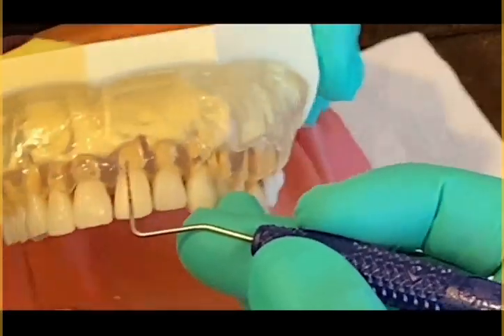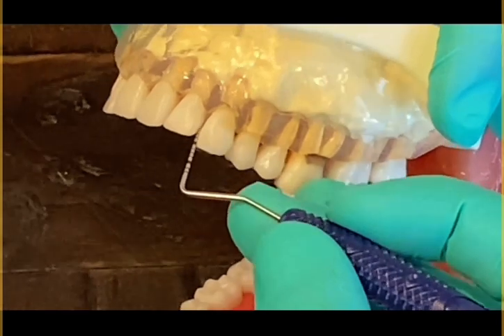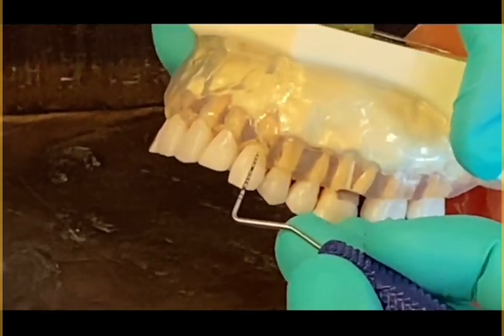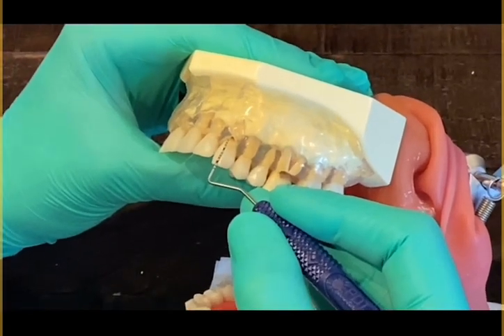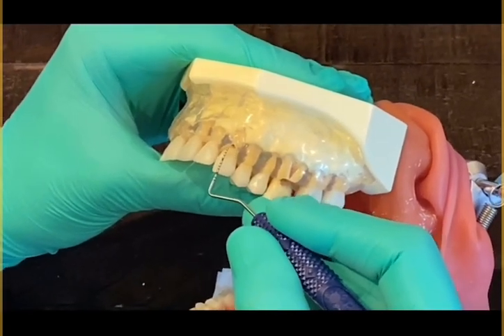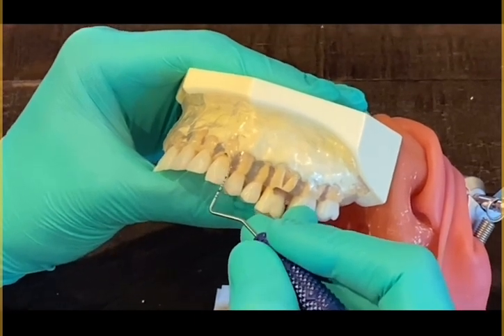Now I'm going to teeth 11 and 12. When you cross the midline, the order changes. Instead of going distal line angle first, you start at the mesial line angle to interproximal, mesial line angle to distal line angle, and distal line angle interproximal.